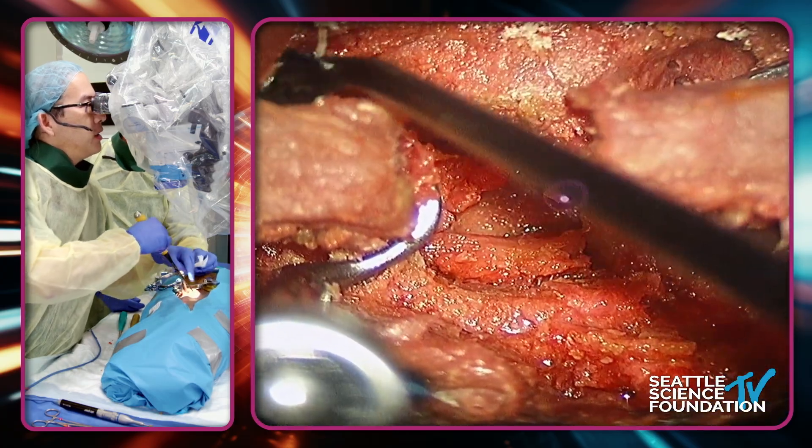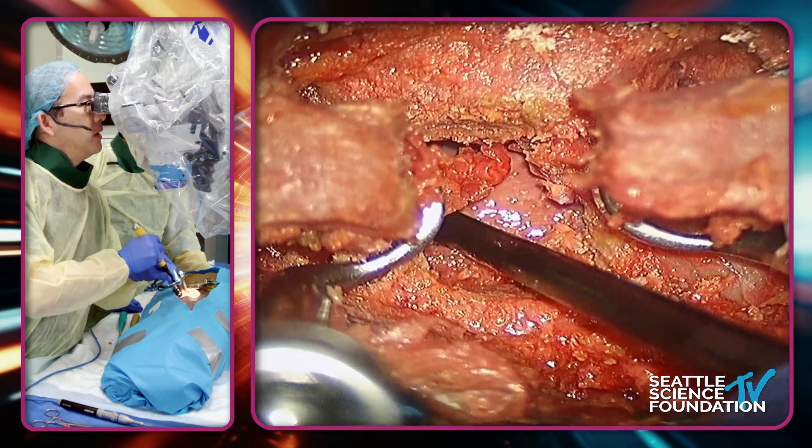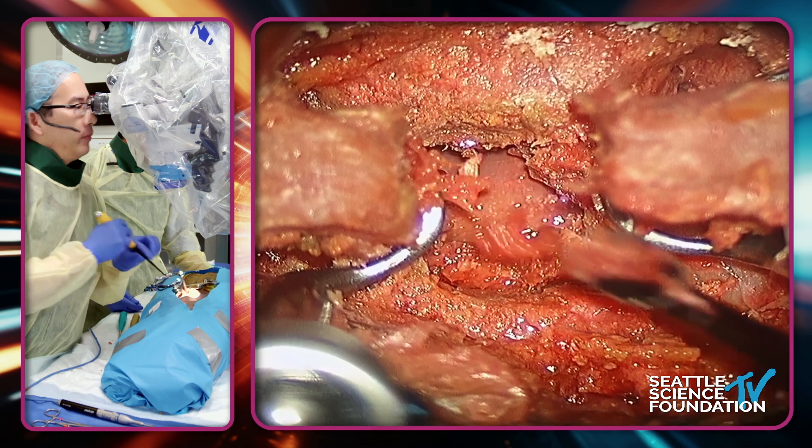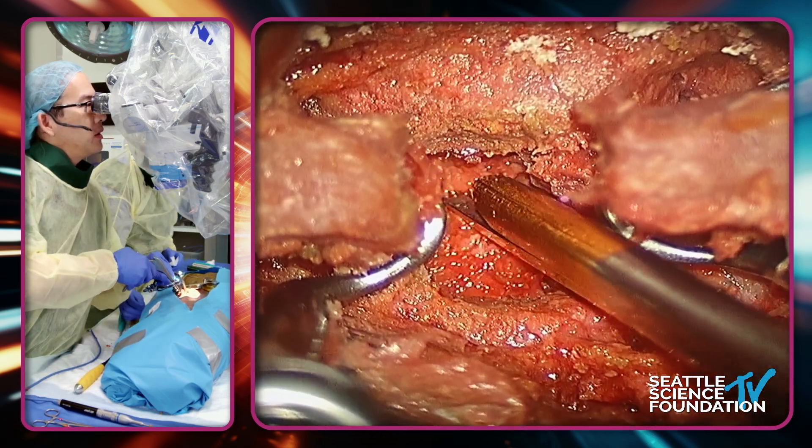Classically you would remove all of this and then you'd be able to see this stuff, but you're not seeing it here. So you decompress with the curette and then bite it away with the Kerrison.